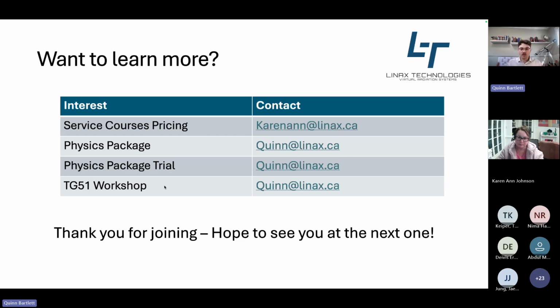And like I said before, I'm offering TG51 workshops right now where I will take your team through a TG51 protocol. It's a great educational session and allows the team to get access and try out our simulators to see if it might be a good fit for your team.